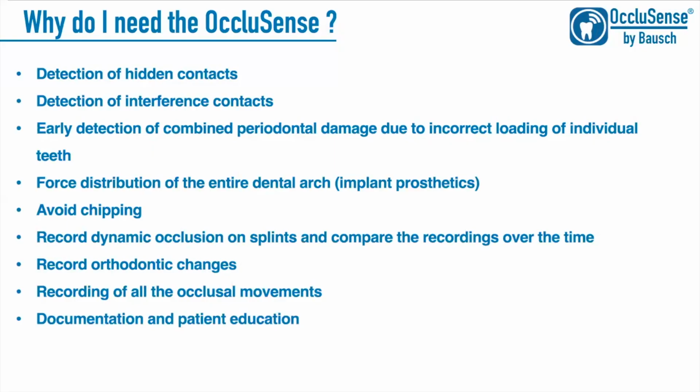What you're also automatically doing is using this output for patient education and documentation, because occlusion is quite a hard concept to explain to patients who are not from the dental field. And using this visualization can really help them understand what is happening.